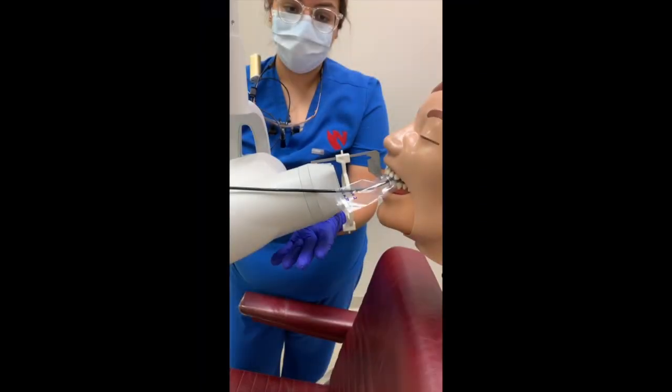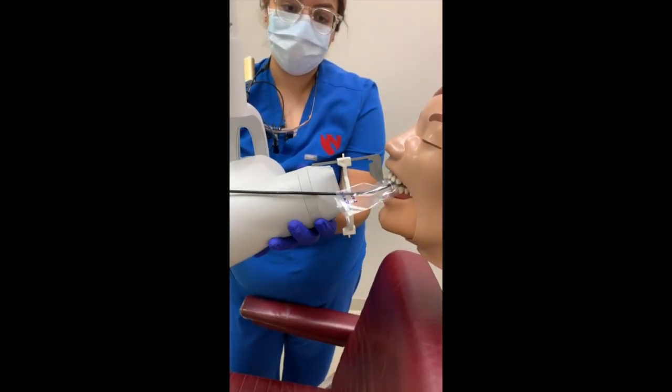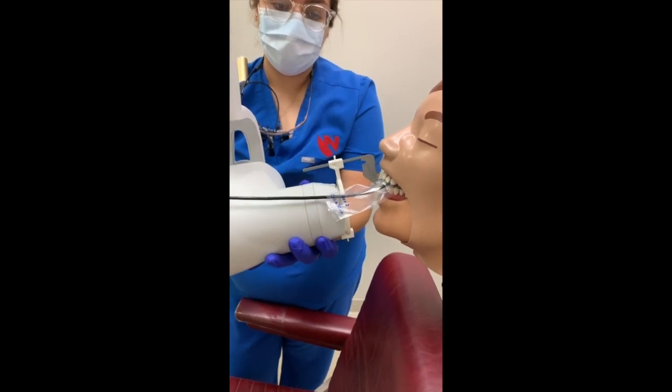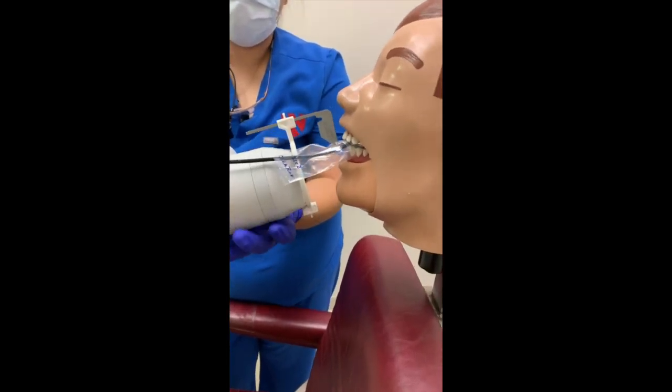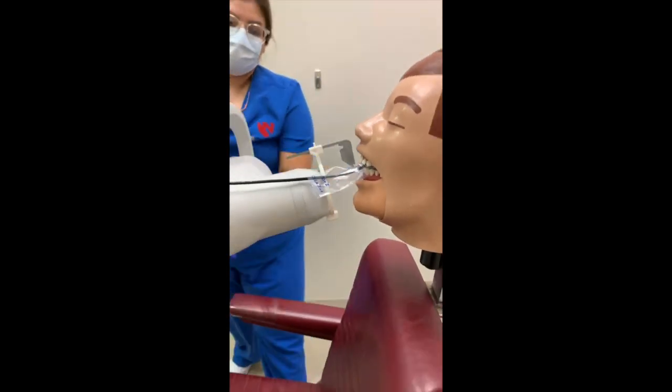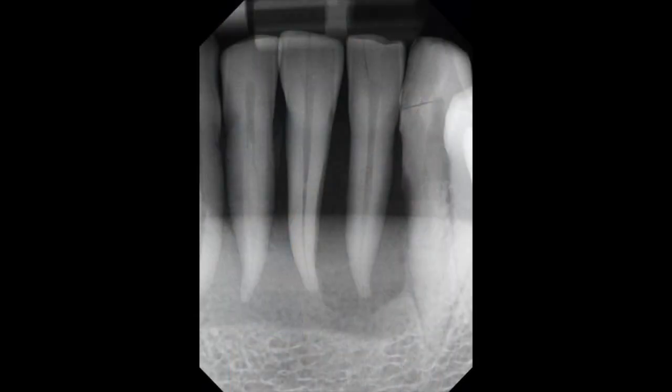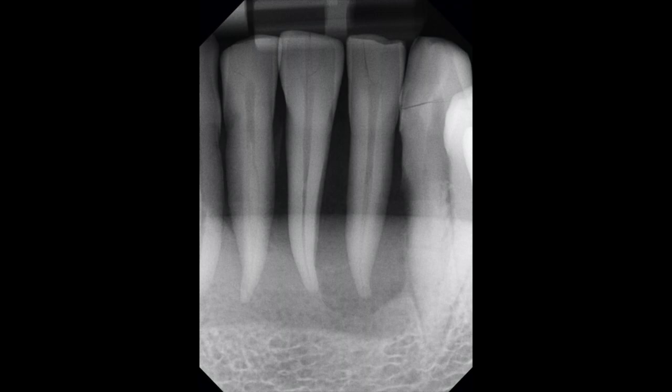It is determined that the x-ray beam is directed too superiorly, and the tube head was placed too high, missing the apices. In order to correct this, lower both the tube head and the PID down slightly to the center of the aiming ring and make it parallel with the attachment bar. When doing this, the newly exposed image will shift the teeth up onto the image and capture the apices.